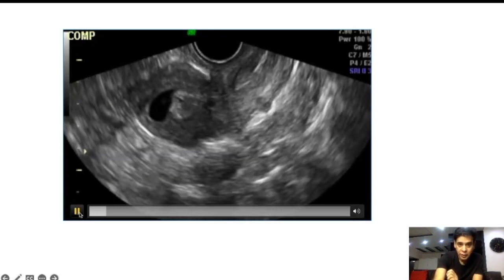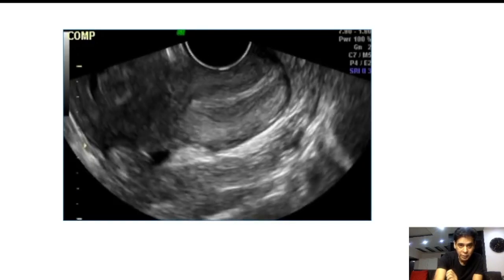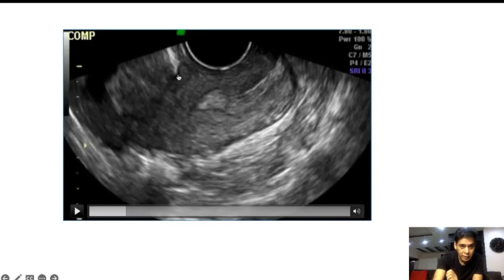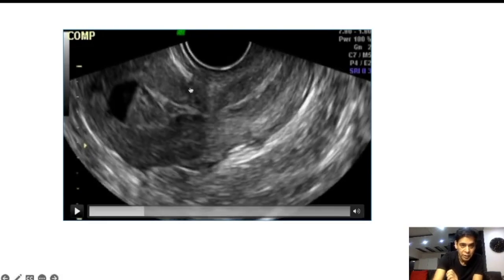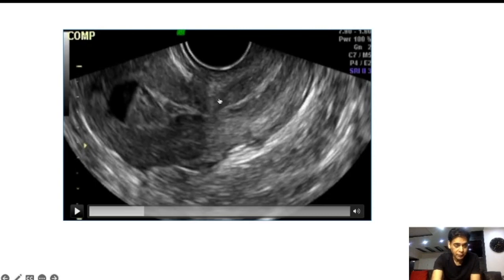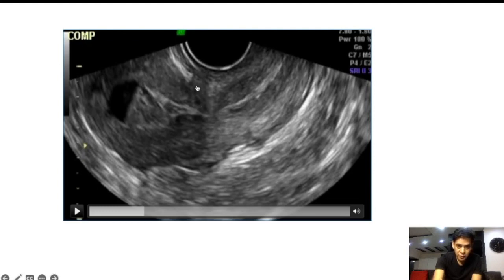As we play the video and look more carefully, here there is a triangular type of contraction of the lower uterine segment. Here again you can make out a triangular type of contraction. And again here, the triangular type of contraction of the lower uterine segment is visible, almost at the level of the isthmus. Just next to it and proximal to it, we can see there is a track which is more or less triangular in shape, and this track has some fluid collection.